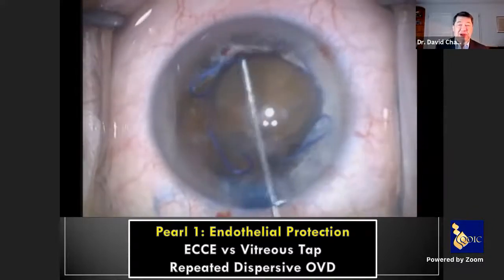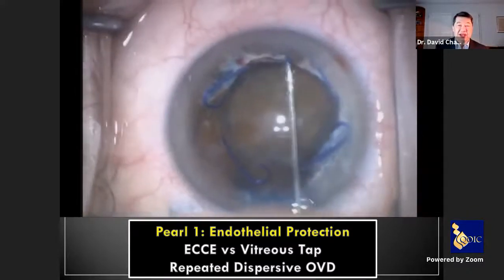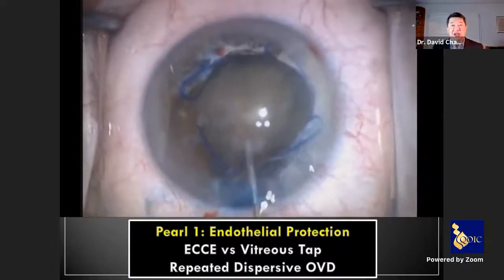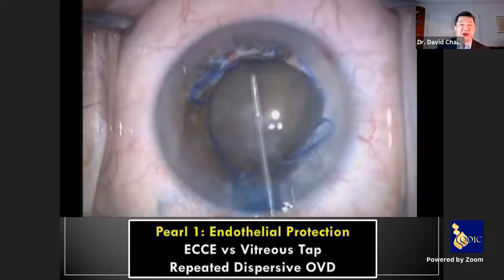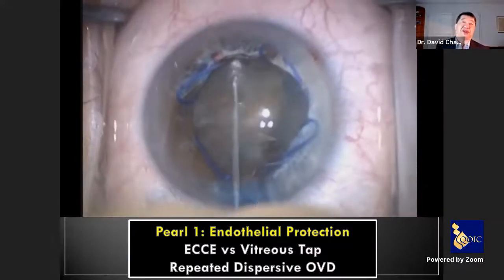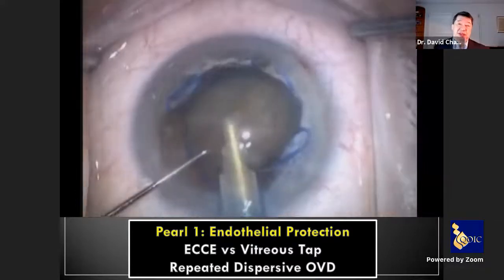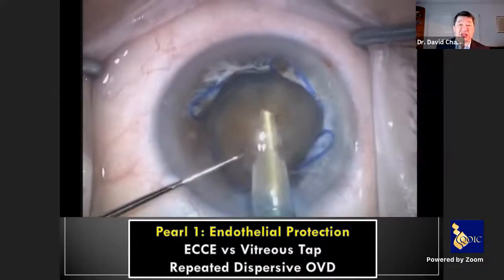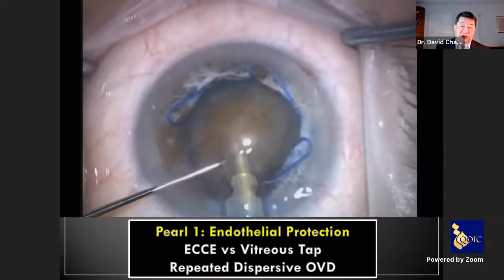And this is the problem that we're going to have here. I cannot turn this nucleus. Now, I know the lens is large, but you usually can turn the lens, especially if it's dense. And if it isn't turning, you have to suspect weak zonules, that there's not enough peripheral counter traction on the capsule and zonules to turn it.